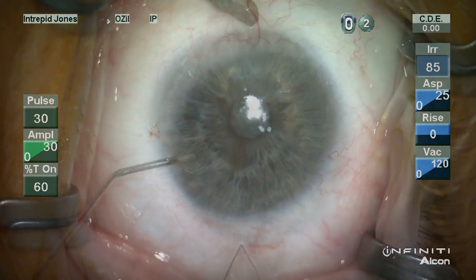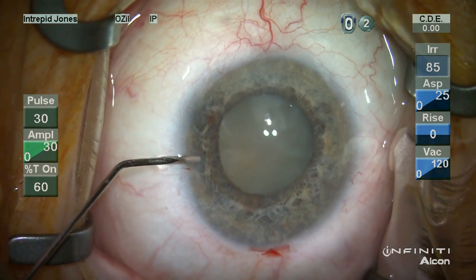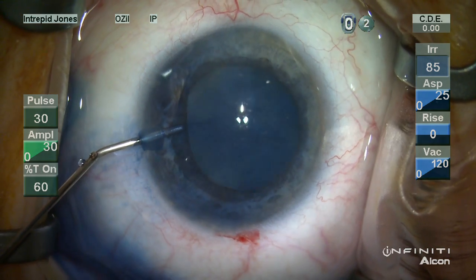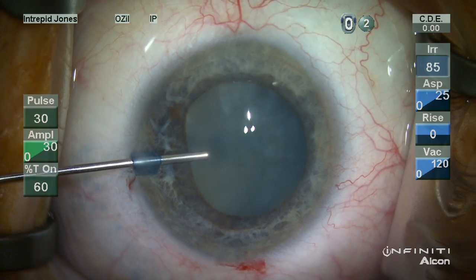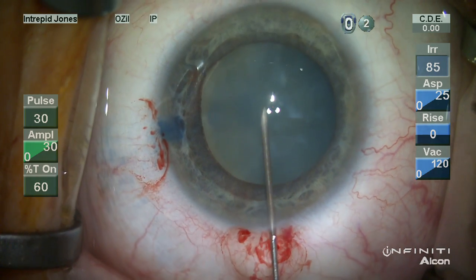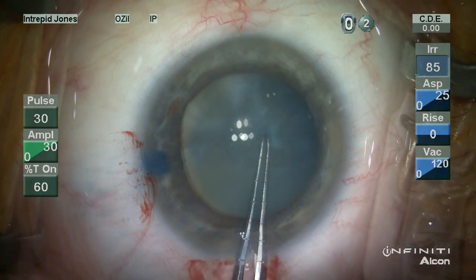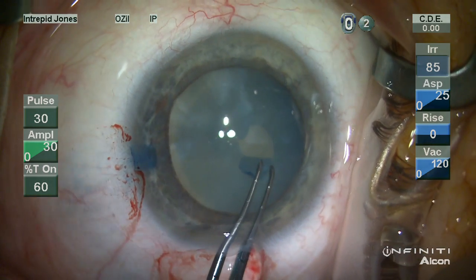You can note here the presentation of the iris to the internal aspect of the temporal clear corneal incision, demonstrating the shallowness of the chamber. The pupil has not been dilated preoperatively. An intraoperative epinephrine is used in measured amounts to help sequentially dilate and deepen the chamber. During the installation of viscoelastic, you can note that the iris still is fairly close to the aspect of the endothelium. There really is not a significant amount of space to maneuver in this eye.